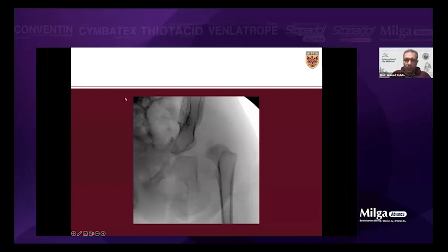For the capsulotomy, I do the T capsulotomy. So first cut is vertical. Here's a femoral head. It's larger than what we see in the X-ray because there's a lot of cartilage on top of it. So I can just mark it here. But be careful when you start your first incision. You ask your assistant to do flexion, so the femur head will go more posterior. So I do a snip with a knife to start to open the capsule. And remember, the capsule is very thick, so don't injure the femur head.